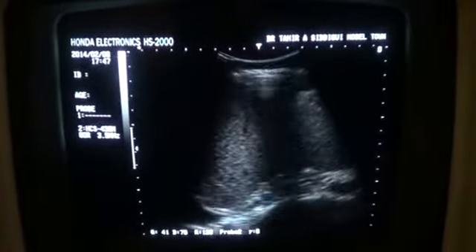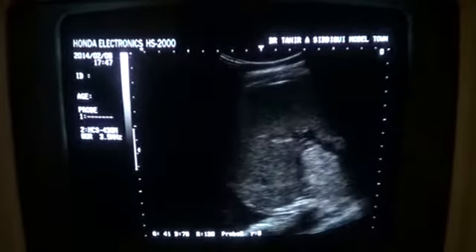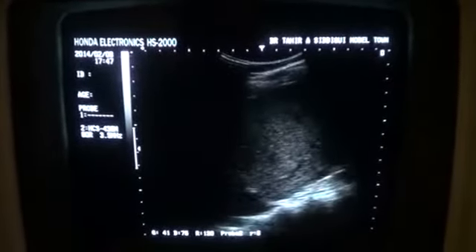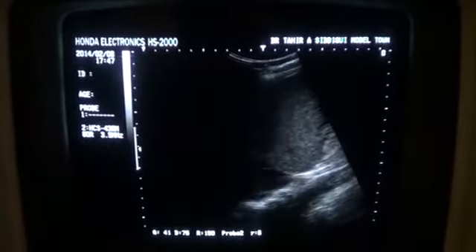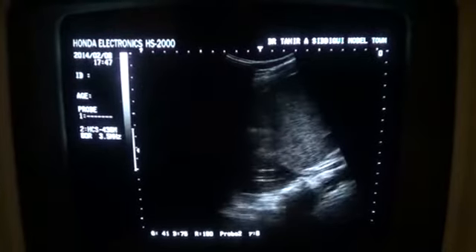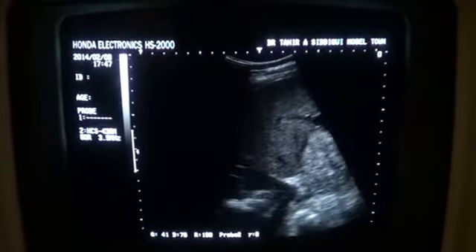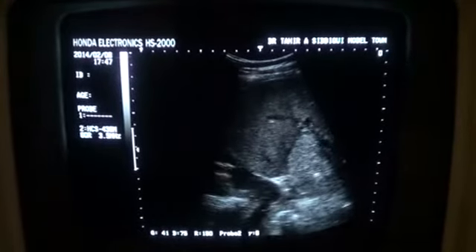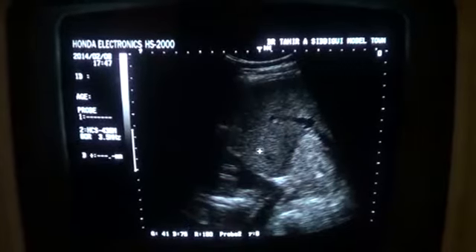This is the ultrasound of a 55-year-old female who has come back from performance of the Umrah and got sick. She says that she got sick over there, and as she is in menopause for the last 2 years, did not use any contraceptive. Blood pressure is normal, her sugar is normal, and this is the liver.